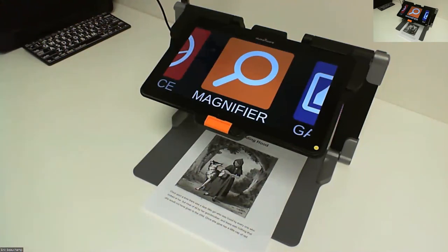That's another option. But the always and then the on request, well, it says it. It's always going to be diamond edge that's going to be shown if there is an OCR. And then you can use the swipe on the right hand side in order to change it to color. But if you don't like that and you always want to have the true colors that are shown and not the diamond edge, that's when you have to choose the on request, because it prevents you from swiping each time on the right hand side of the screen. That's to answer that last part of the question that I have there.